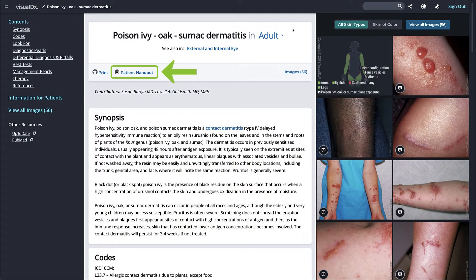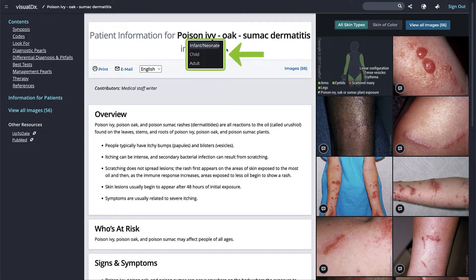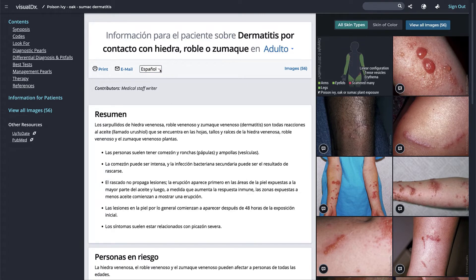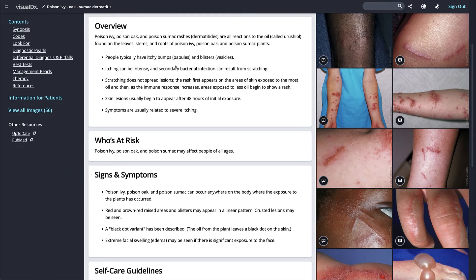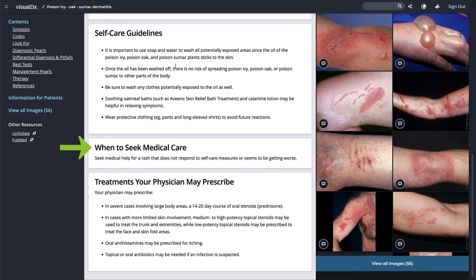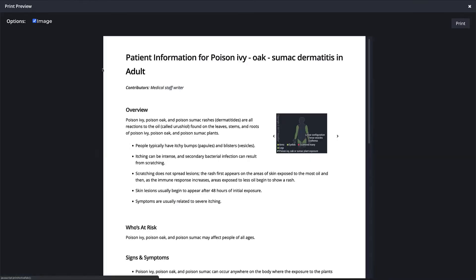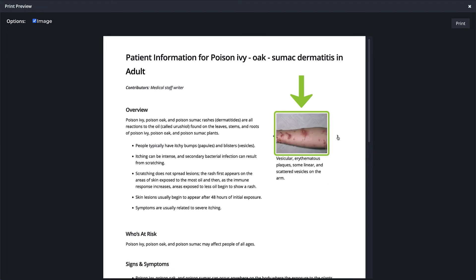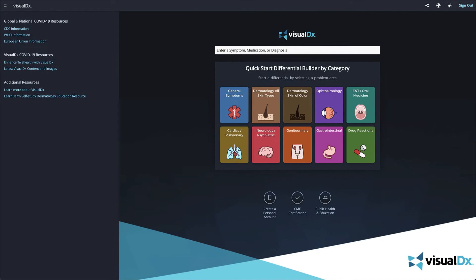VisualDX also provides handouts for common and important diagnoses. Click 'Patient Handout' underneath the diagnosis title, or click 'Information for Patients' on the left navigation menu. Choose to provide a handout for an infant, neonate, child, or adult with the diagnosis. Select the language in which your patient would prefer the handout — the text is written so that patients will find it easy to read and understand. The handout includes a quick overview, who's at risk, signs and symptoms, self-care guidelines, when to seek medical care, and treatments you may prescribe. You can print or email the handout, and choose to include an image that best matches your patient.